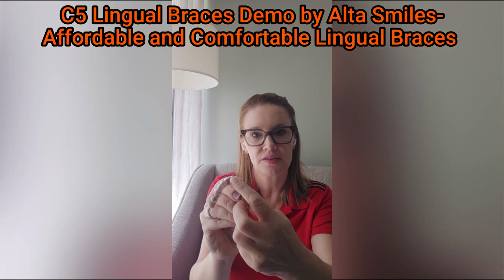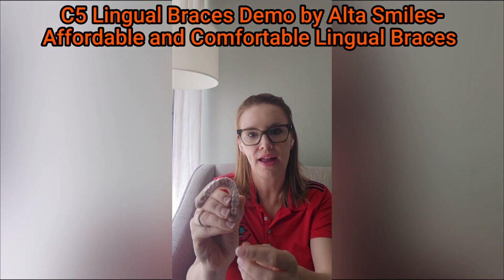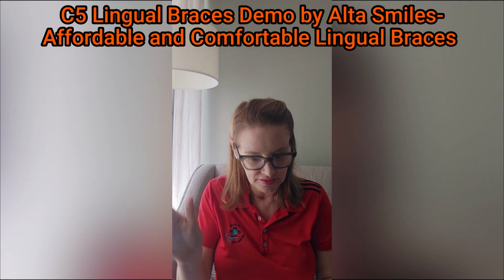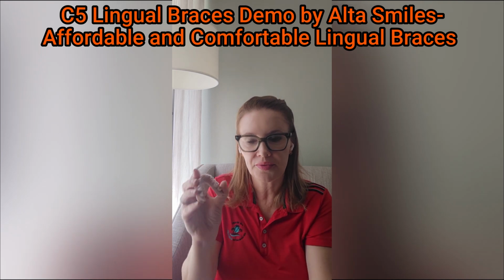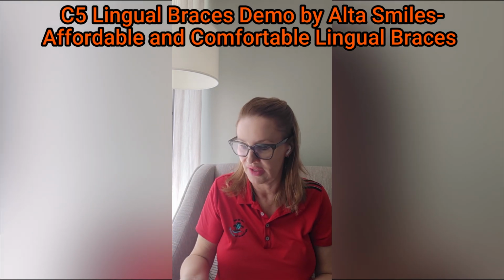These are just like little elastic threads or elastic tubes that help to stabilize it where it's supposed to go, and you just put it on, same thing, dots of glue, just like indirect bonding. Slap it on, bite down, light cure, peel it off, trim these little threads off, and you're done, which stabilizes it, kind of like you do with floss when you put a bonded retainer on. So that's all it is.